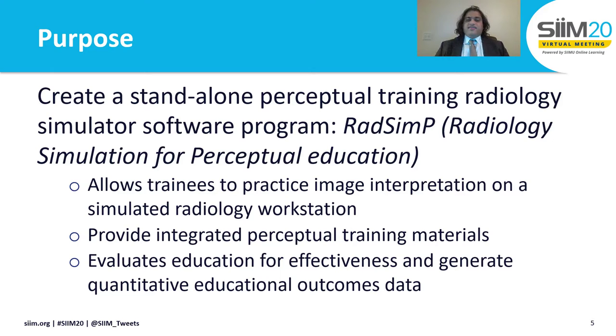Our purpose was to create a standalone perceptual training radiology simulation software. We called it RadSimPE, short for Radiology Simulation for Perceptual Education. The goal is to allow trainees to practice image interpretation on a simulated radiology workstation, similar to what real radiologists use, provide integrated perceptual training materials, and evaluate education for effectiveness and generate quantitative educational outcomes data for research or QI.